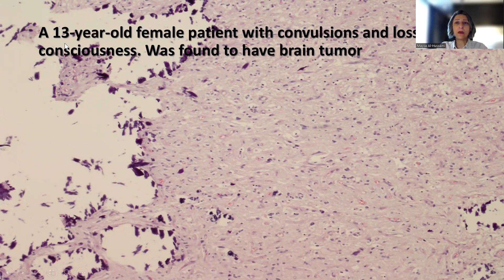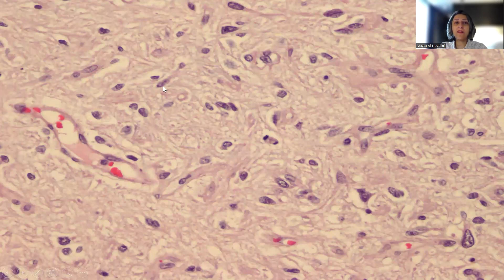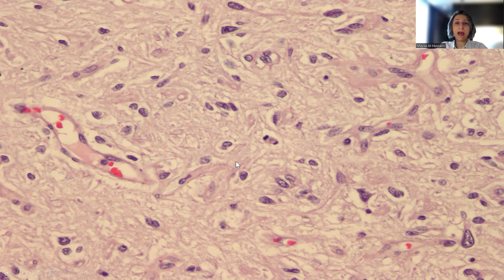As you can see from the low-power magnification, there are loads and loads of calcification, which is typical of this tumor. In addition, there are areas that look like low-grade glioma on high-power magnification. Honestly, this looks very much like low-grade fibrillary astrocytoma, as if it is an astrocytic tumor. There is a single mitotic figure here, and the appearance of the tumor cells really looks like astrocytoma.